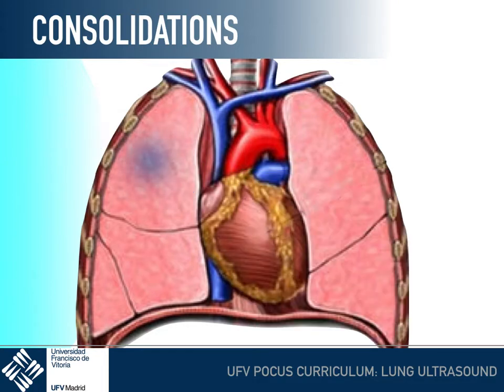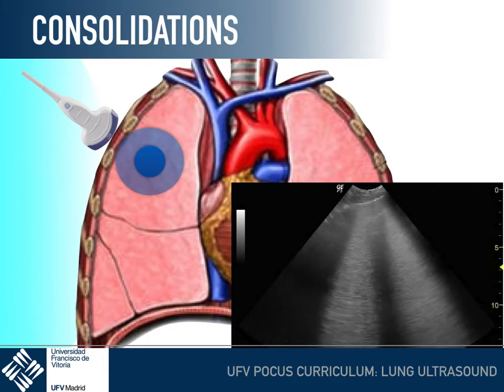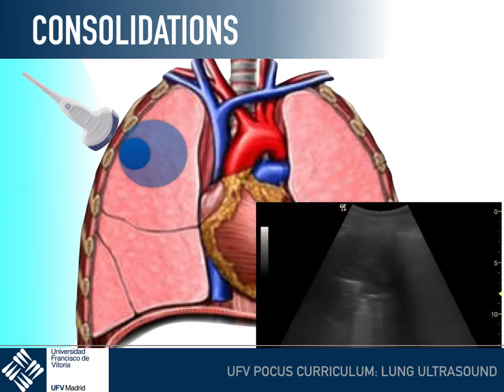If the halo of inflammation touches the pleura but not the consolidation, the halo of interstitial affection creates B lines, but there's no way to see the consolidation below the B lines, because B lines are artifacts as well. They're not real images.